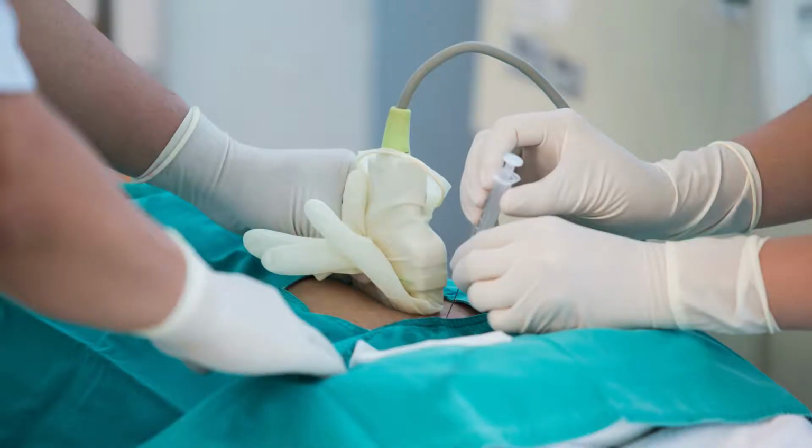In my practice setting, it is not uncommon to see patients with known ascites. They will often have related complaints of abdominal pain, fever, or shortness of breath, all requiring me to perform a diagnostic and/or a therapeutic paracentesis. While not necessary, I would strongly encourage you to use ultrasound to guide your procedure.